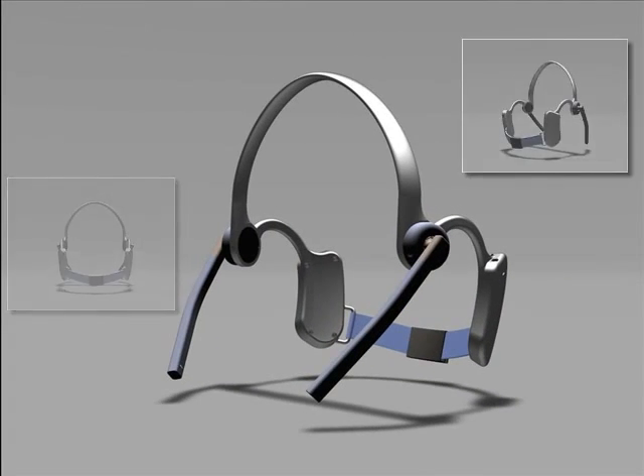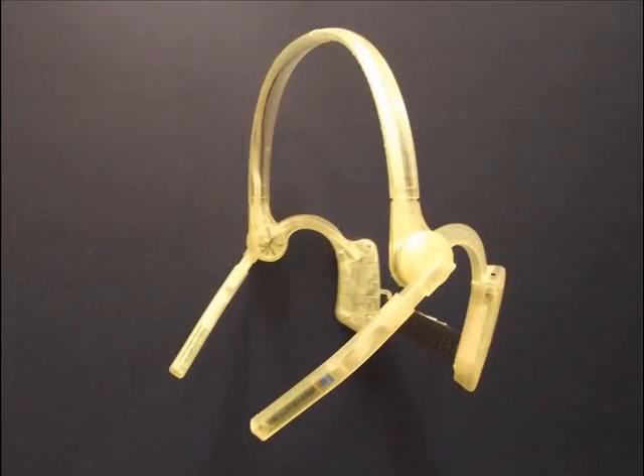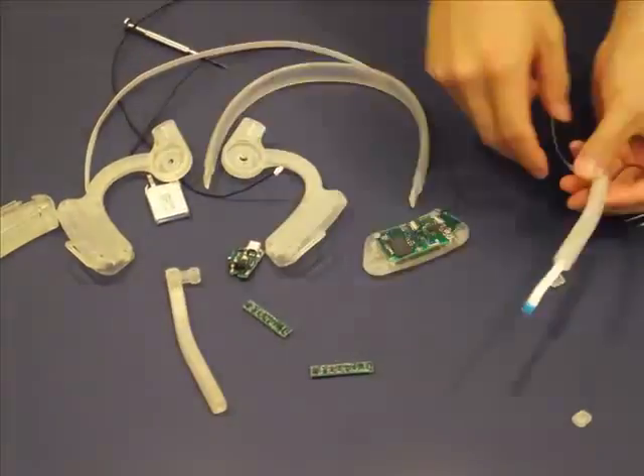Here is a 3D model of the tongue drive system in SOLIDWORKS, and here is a prototype fabricated using a rapid prototyping process. After the headset is manufactured, all the components are assembled together manually.